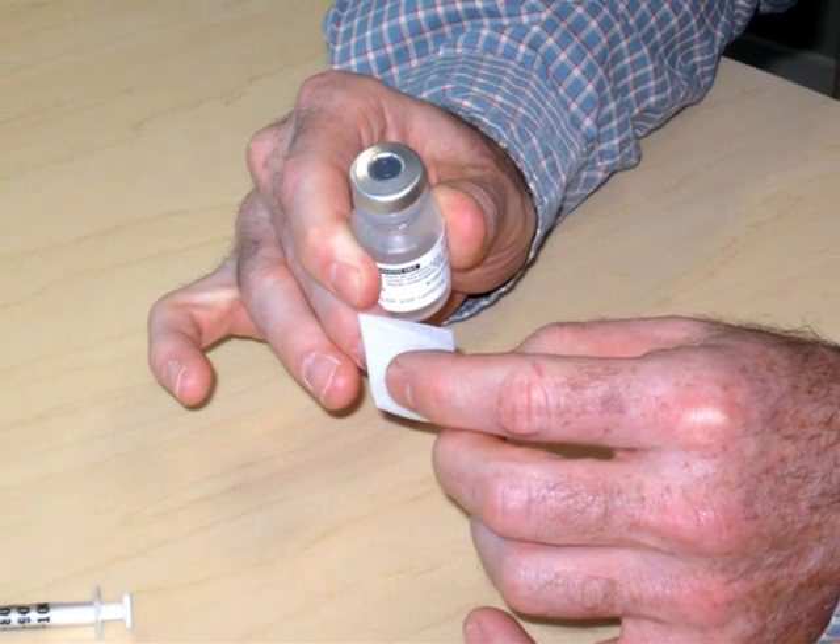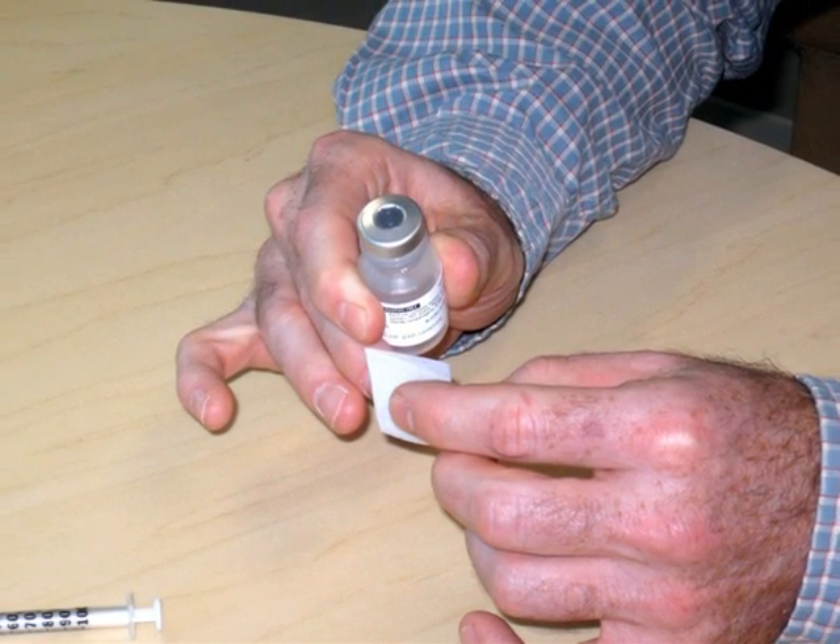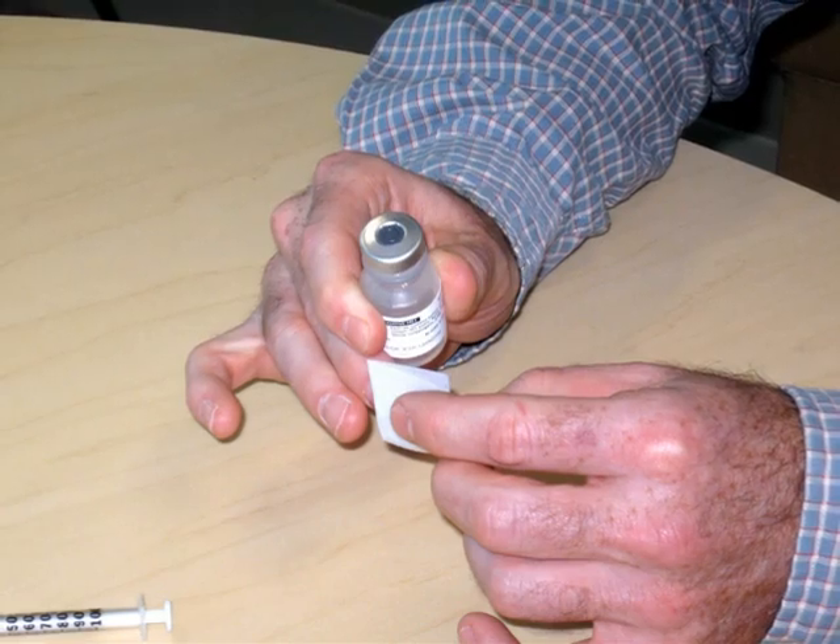In the first step, take off the cap and leave the gray stopper in place. Wipe off the top of the vial with the alcohol swab.